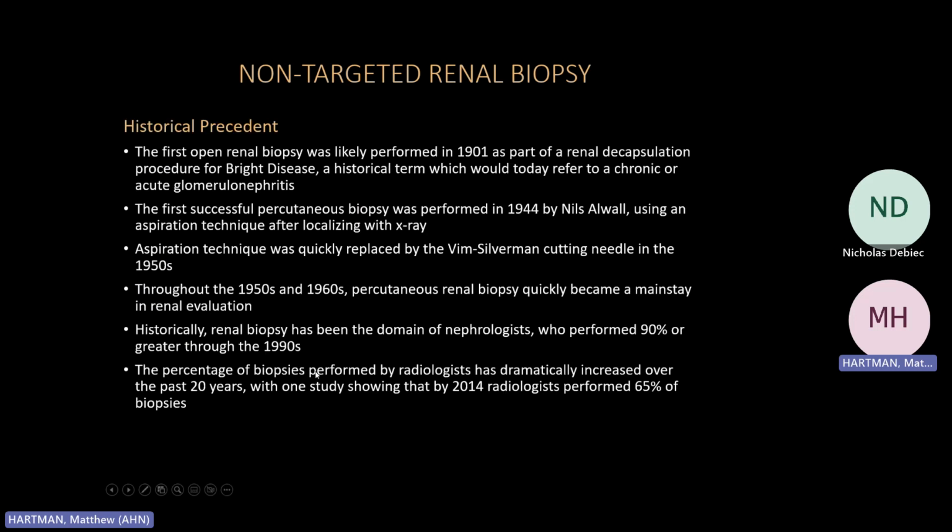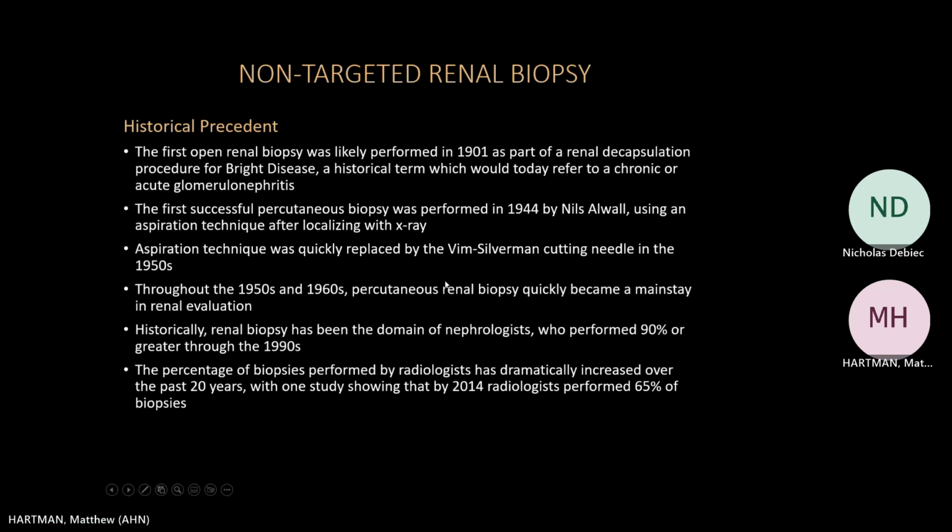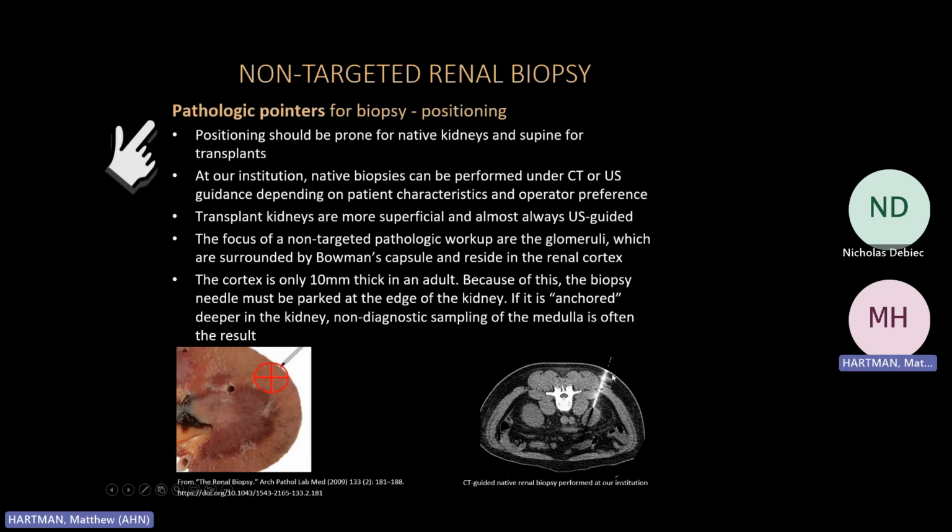These biopsies can be performed either under ultrasound, which is how I like to do them, or via CT, which is sometimes easier if you have an obese patient and need to get through a lot of fat, remembering that fat is our enemy with ultrasound and makes the imaging challenging.